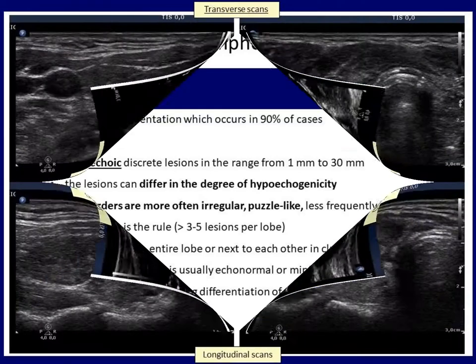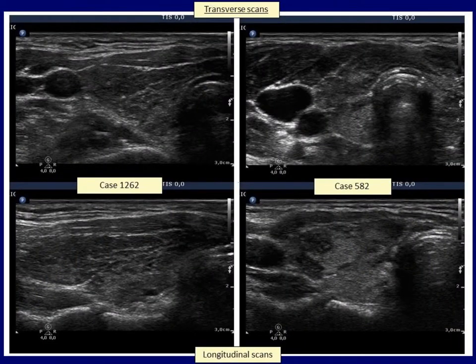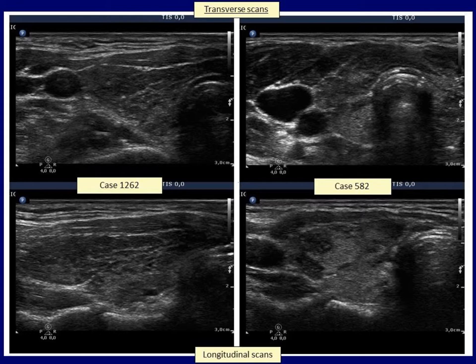The distinction from true nodules and the issues regarding the differentiation belong to another topic discussed in the advanced section. I give only two examples here. The left case should not cause concern — the thyroid is hypoechoic and has more hypoechoic discrete areas, which is the typical representation of lymphocytic thyroiditis. However, if we were to stick to the ATA definition, we would have to call these discrete lesions nodules. The case on the right is much more problematic, nevertheless the shape of the discrete lesions and their multiplicity clearly suggests these are more active foci of thyroiditis than true nodules.